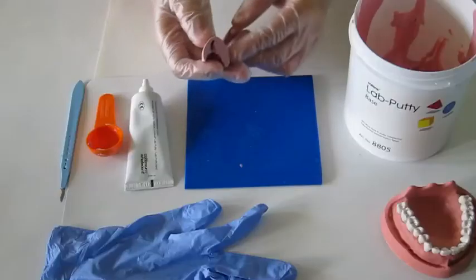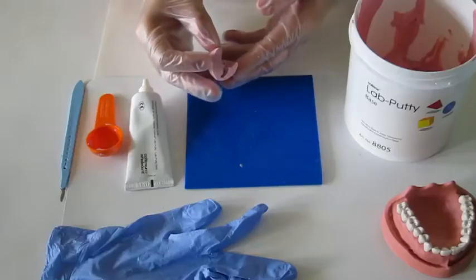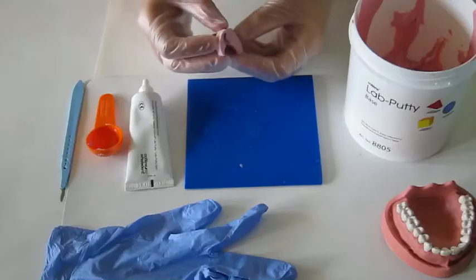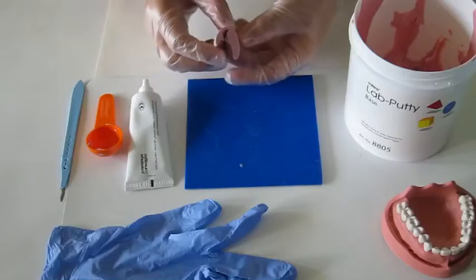In this demonstration, I will show you how to make a silicone index. A silicone index is a very helpful method during crown preparation, especially for beginners, to check the tooth reduction across the entire facial and palatal surfaces.